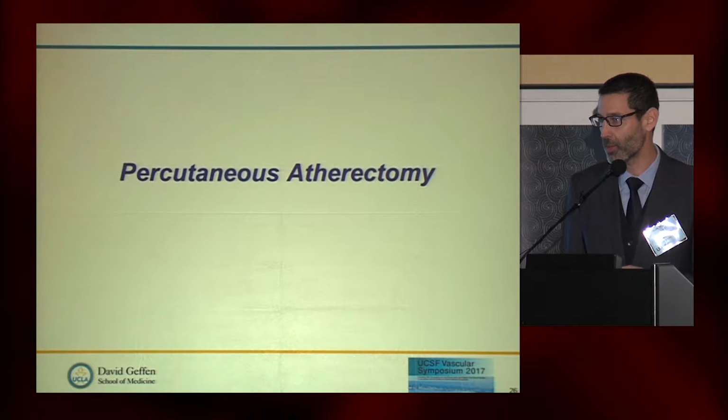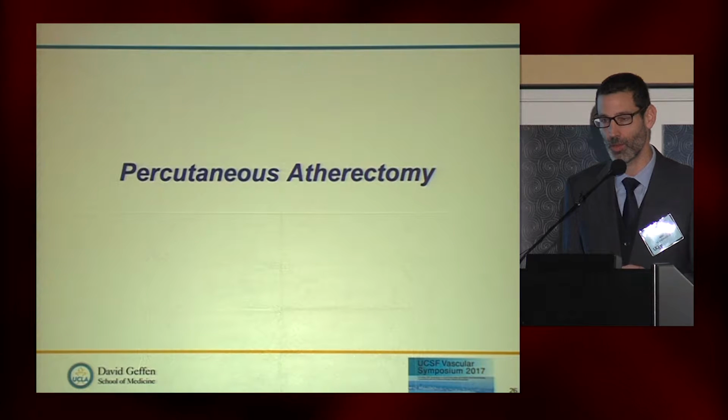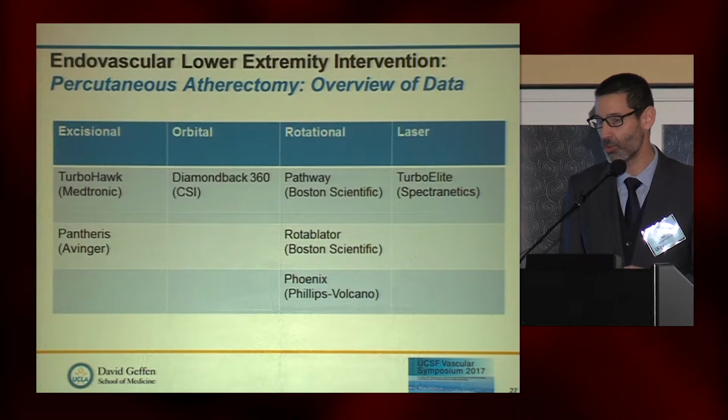So percutaneous atherectomy, I want to move into this. This is a bad word in some surgical circles, certainly, and I think there's good reason for this. The data for percutaneous atherectomy is very scant, considering the wide adoption, the high reimbursement, and the high cost of these devices. I do think this is a useful tool, but I also would say these are actually multiple tools. One of the things to keep in mind about atherectomy is that there's not one type of atherectomy. There's at least 4 different types of atherectomy and different devices within these categories. And this also sort of blurs the data when we try to evaluate these devices.